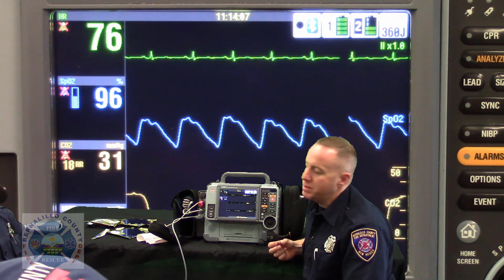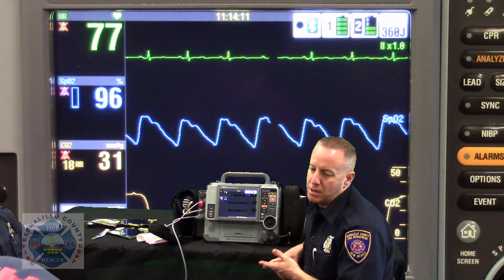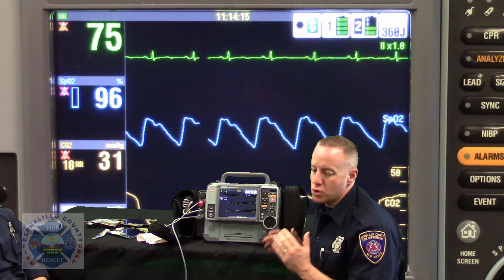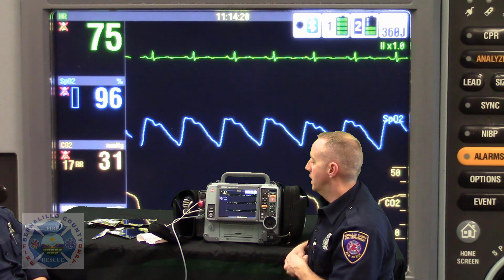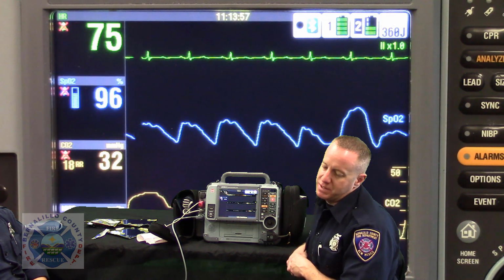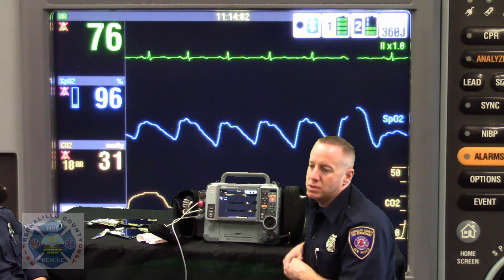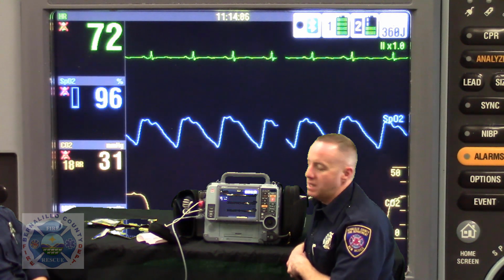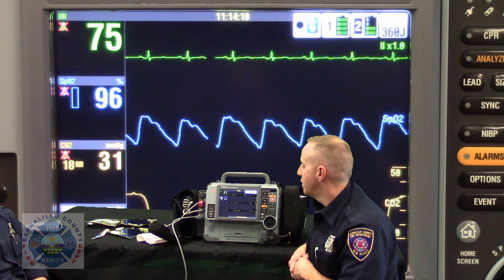And if we transmit with the correct name, age, gender, date of birth, everything we talked about for a successful EKG transmission, to shorten the amount of time that patient has to wait for their reperfusion therapy, if it's on account of electrodes that were just placed in a Ziploc bag, it just doesn't make sense. So make sure that you use fresh electrodes, you're not pre-staging them on the cables, you're not saving yourself any time by doing that. So here we have our patient wired up for 12 lead.